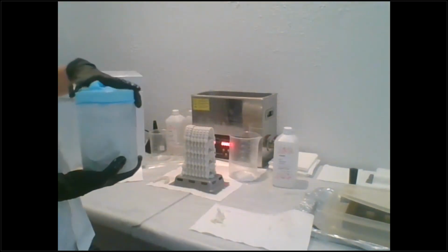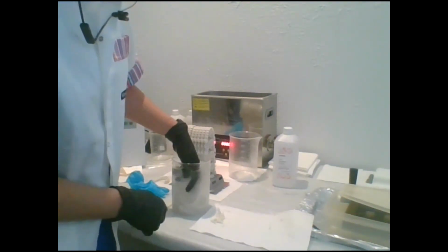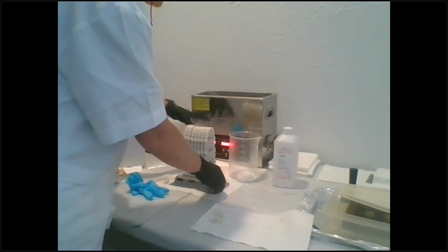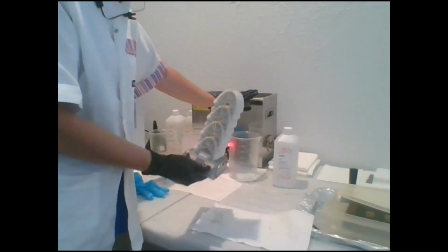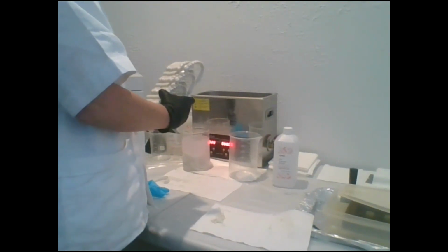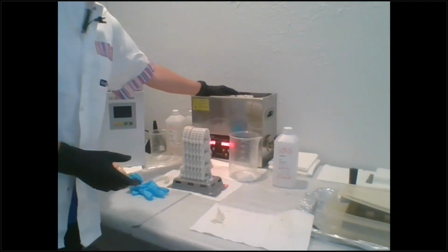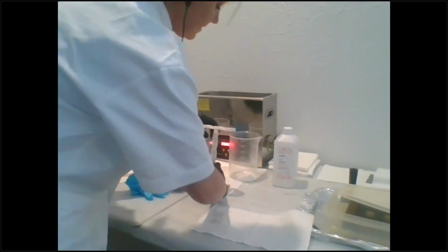So you always want to do a clean bath, okay? And what I do is I put all of my arches in. I actually like to take my arches out and put them in the opposite direction. And you'll also see that with your full stacked arches. So I don't actually have a big enough ultrasonic because I'm not at the lab. But if you were at the lab and you could clean the whole stack at the same time, you would break off the stack and you could put them in the larger tub, one direction for 3 minutes, all of your stacks.